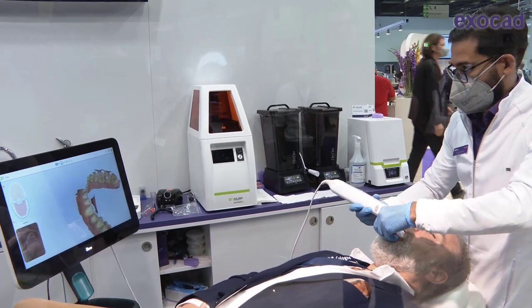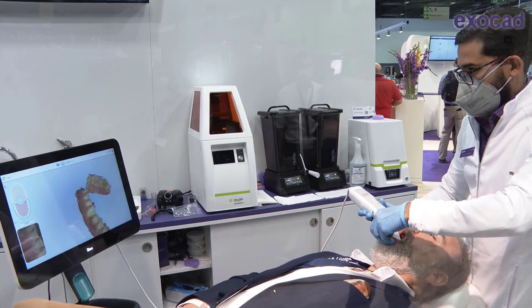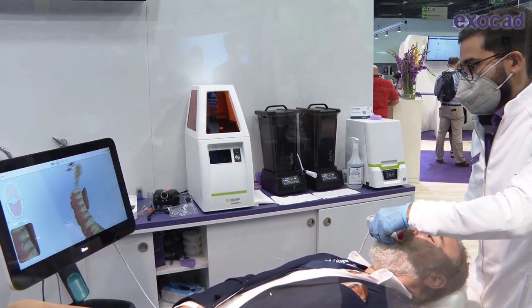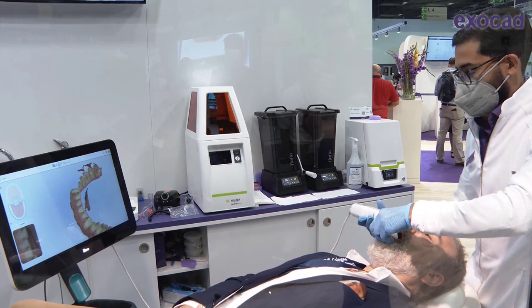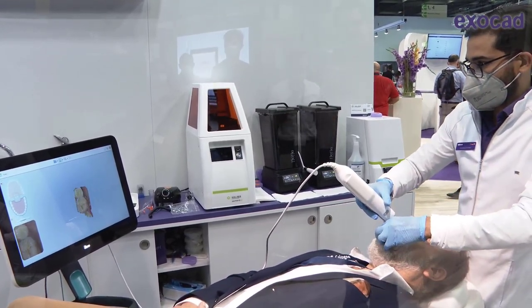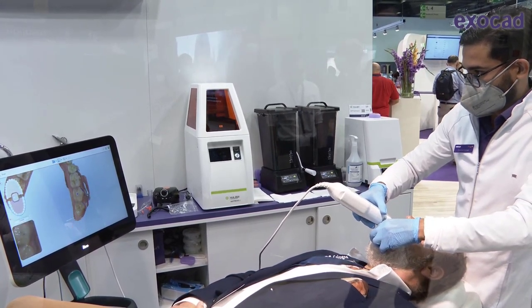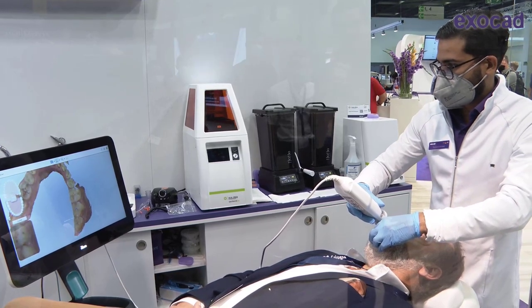Again, for the lower arch we follow exactly the same scan path: occlusal first, lingual back, then buccal one side. At the midline, a little twist over the inside of the ridge, then back to the last molar on the right — start occlusal, get the reference point, twist over to buccal, and finish with the fourth quadrant on the buccal side.